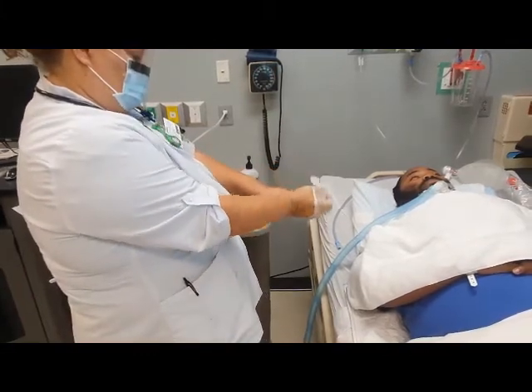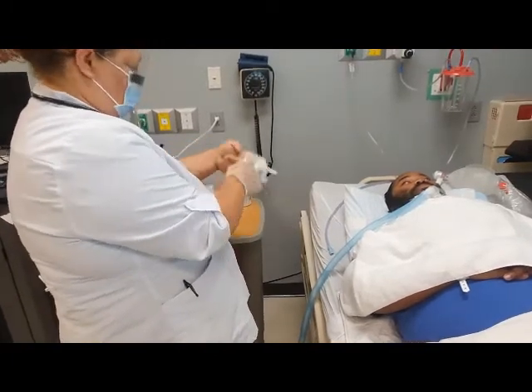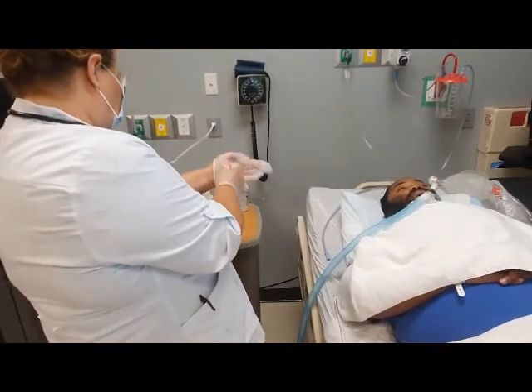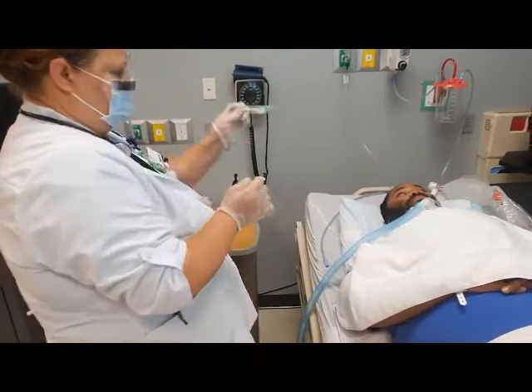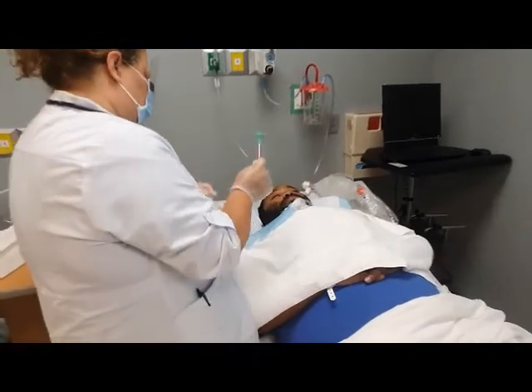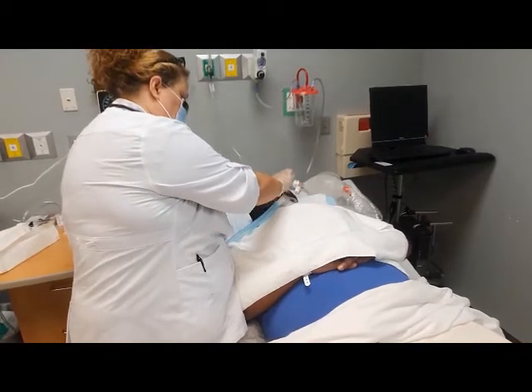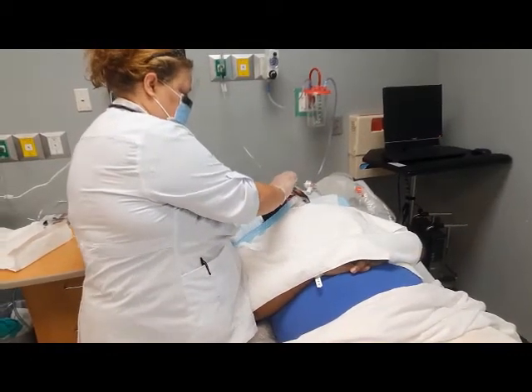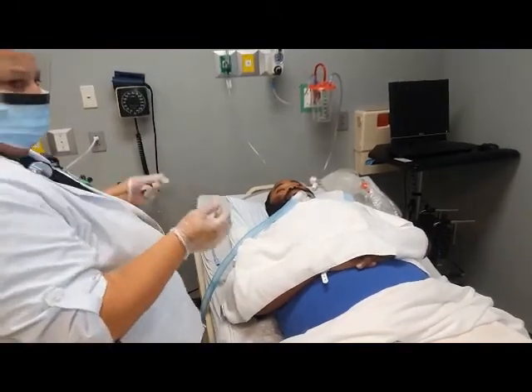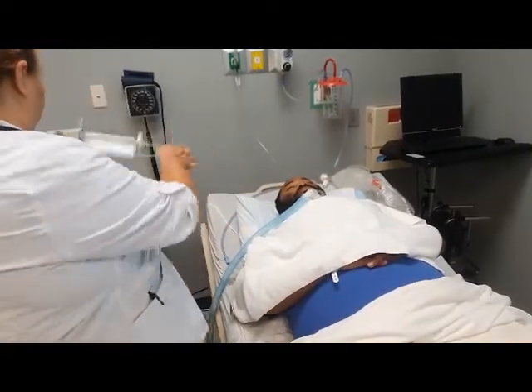Provide oral care at this time. So I got in my oral kit earlier. We'll open it up. Hello, Mr. Smith. I need to clean out the inside of your mouth. Can you open your mouth for me, please? And then you clean inside the mouth and around the teeth. Then you take the swab and you dispose of it in the garbage. Then remove your gloves, mask with eye shield, turn off your suction and your O2 supply to the bag mask.